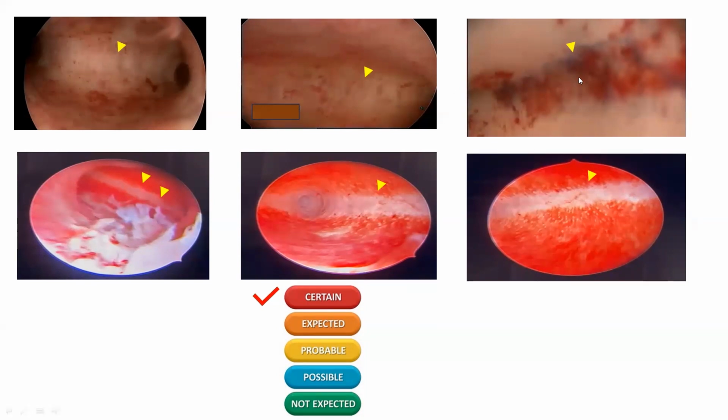If the examination is done following menstruation or there is some bleeding, this defective part of the endometrial cavity is stained with blood.